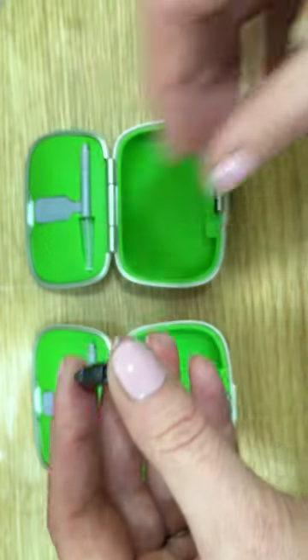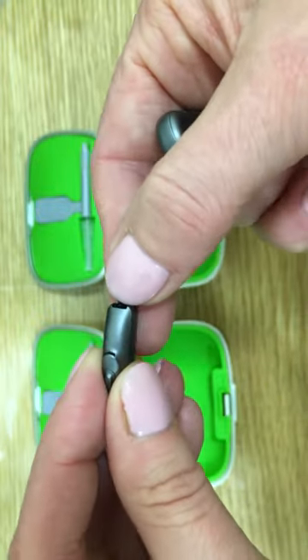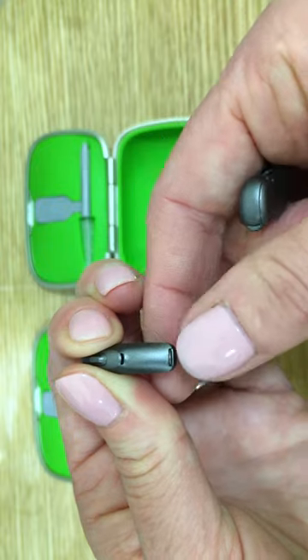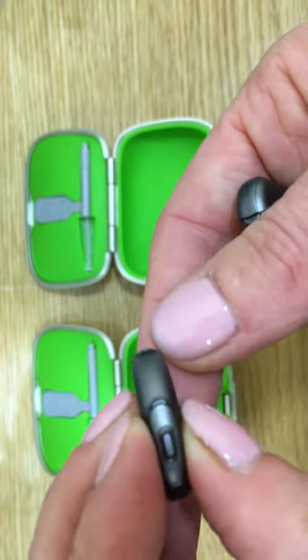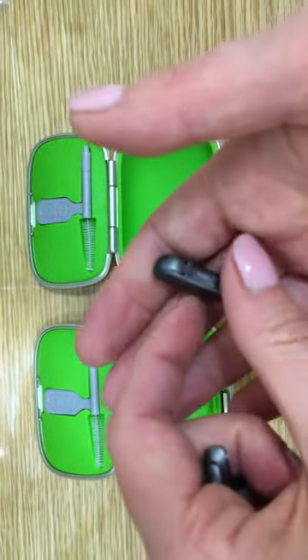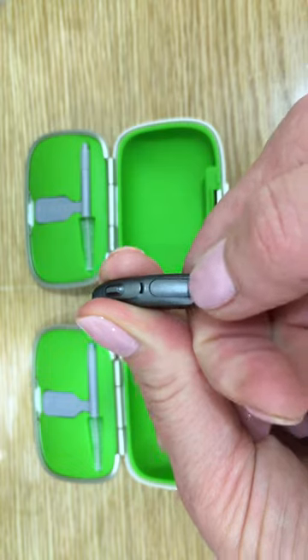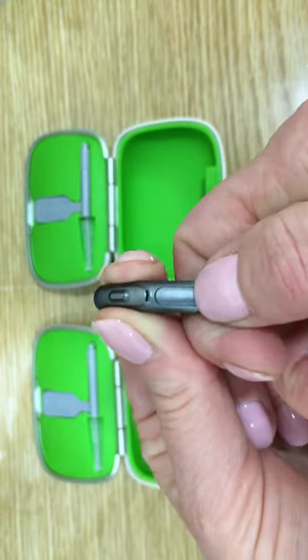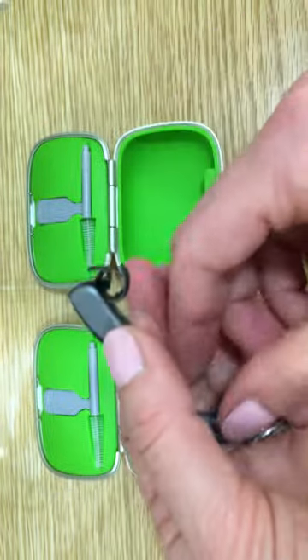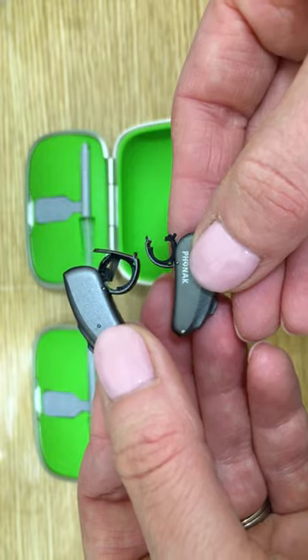Firstly we will see the battery components — battery doors. On the left, on the size 10, we have the battery chamber at the bottom of the instrument and the battery drawer opened using this little lip over here. On the 312 instrument, the battery chamber is also opened with a little lip at the bottom, however it opens from a slightly different position. So here we can see the difference in the battery size.